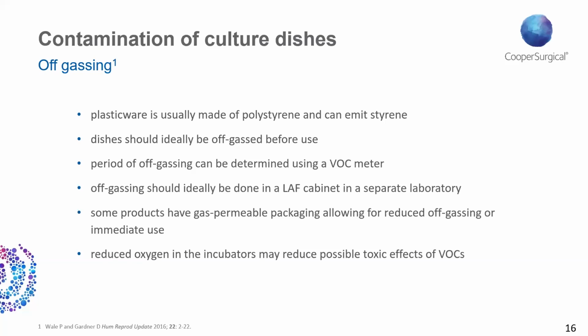We're lucky that because of the way we culture now in reduced oxygen, this may reduce the possible toxic effects of VOCs. So in the future, we may go down to even lower oxygen tensions than we do now, but they do help in the control of the effects of VOCs, not in the VOCs themselves, but in their potential effects. So don't ignore VOCs.